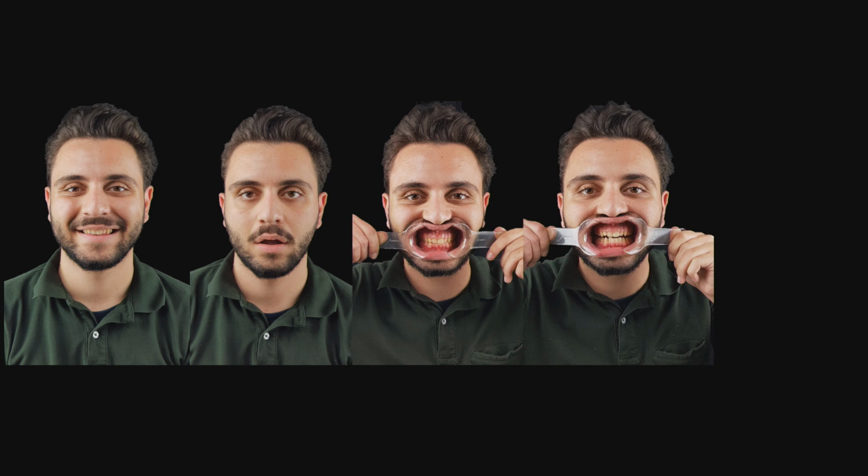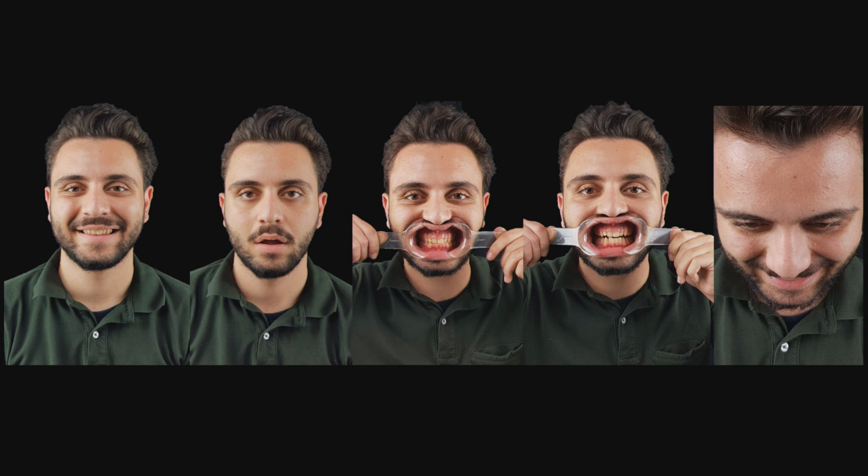This is important, the lips to be absolutely rested to define the new incisal edges. The third picture is retracted lips in central occlusion. The fourth one is retracted lips with open bite. And the last one is the 12 o'clock picture. This way you can see the vestibulolingual position of the teeth and the width of the teeth.